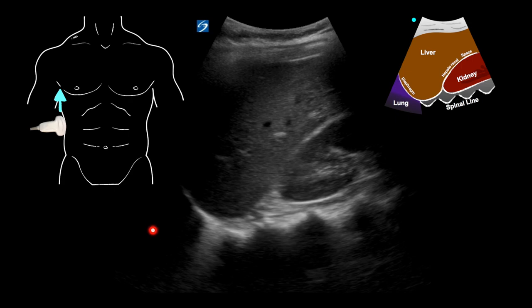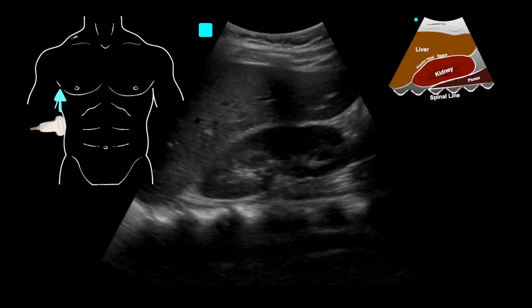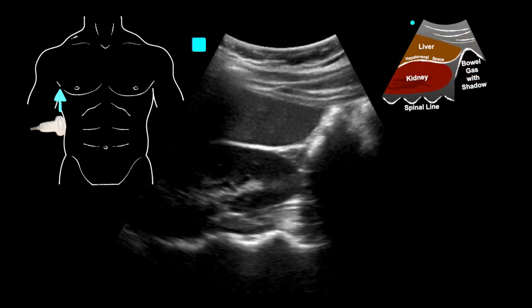We're going to evaluate the pleural space for free fluid. Then we start working down through Morrison's pouch and evaluating for fluid. We may need repeat views, and we should take caution around rib shadows. Coming down around the inferior tip of the liver and kidney, we reach what's called the paracolic gutter — the first area where we'll see free fluid in the abdomen. Free fluid collects right in this area first, then tracks up through Morrison's pouch.